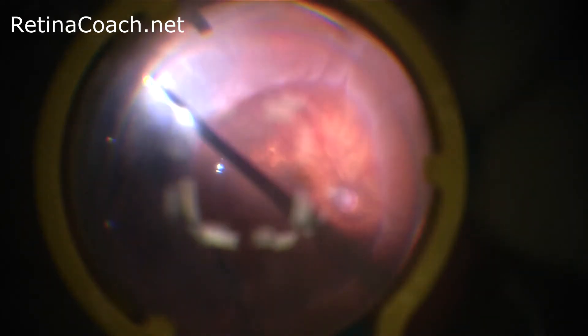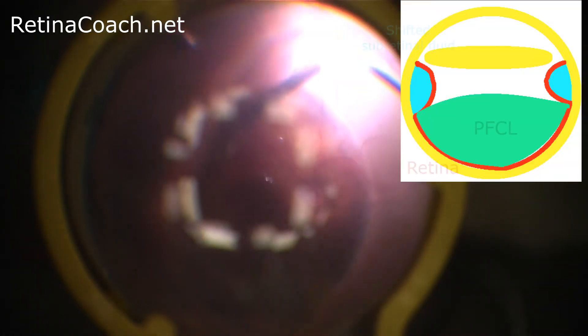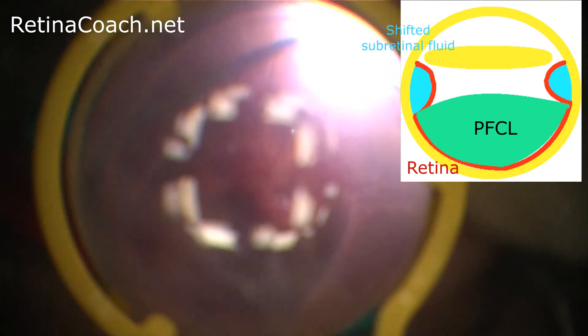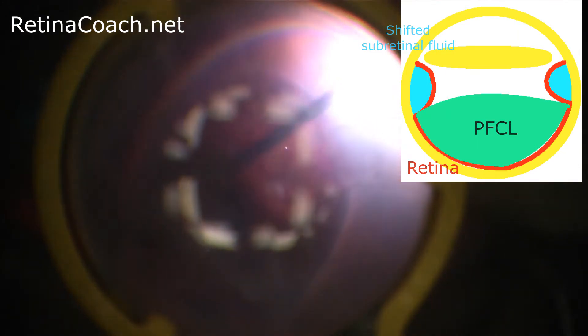Stabilization of the posterior pole of the retina with perfluorocarbon provides anterior shifting of the subretinal fluid, thus elevating the peripheral part of the retina, which assists in peripheral shaving even without scleral depression.